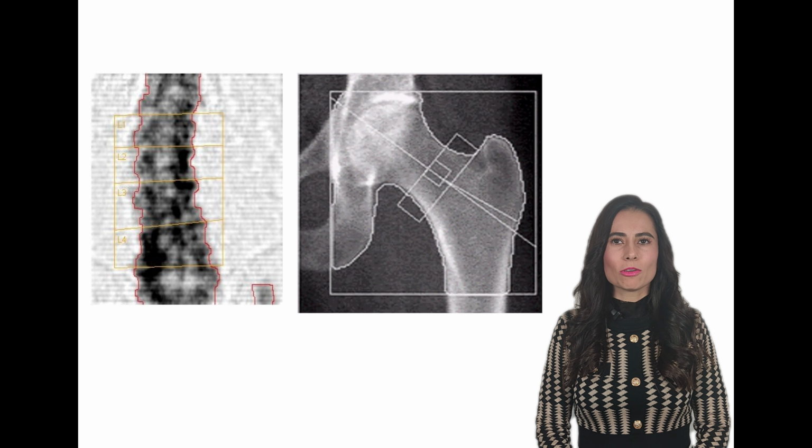Precision is not the same as accuracy. Precision is when you repeatedly hit the target. When it comes to osteodensitometry, this means that for the device to be precise, it should accurately diagnose osteoporosis, osteopenia, or normal bone density multiple times.